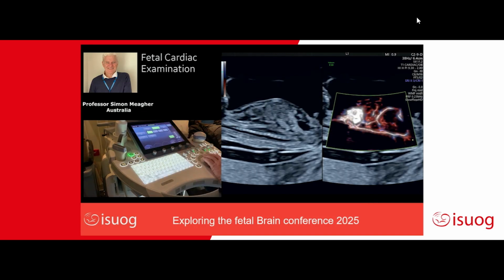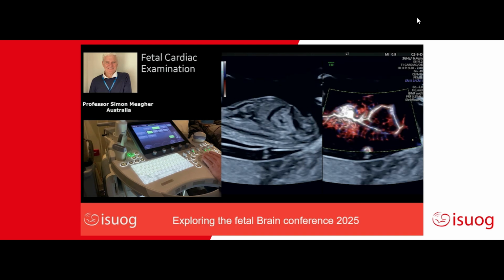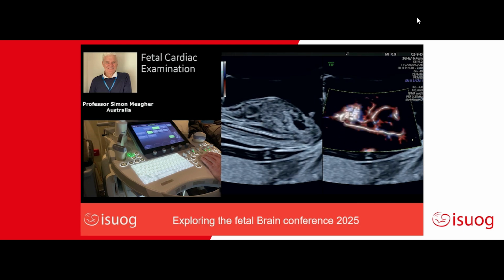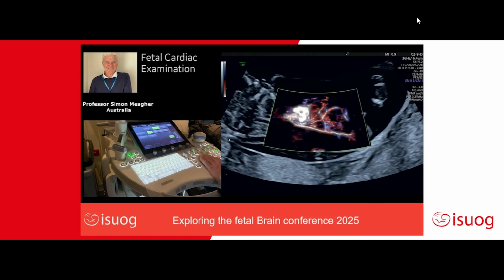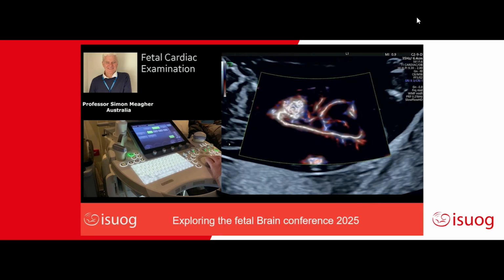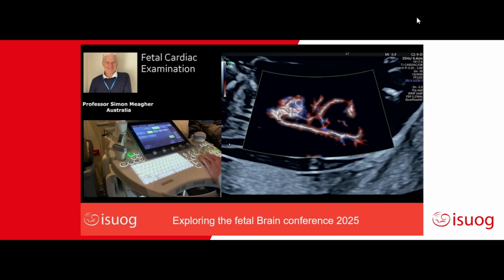And that allows you just to work out exactly where you are in 2D as you look at the left screen, and then it just tidies up, in a sense, the vascular imaging that you're getting with the background off. And when I then go to full screen with background off, I can then look at the full circulation. I can just simply magnify that and take out all my grey information, and now look at all these tiny vessels. Once I've got to this point, I just ask the patient to hold her breath.